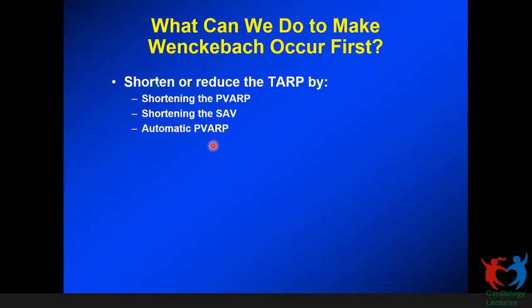So in a normal pacemaker age group of patients who will be 65 or older, the nominal settings will be appropriate. The upper tracking rate will be 130 beats per minute, which will give 1:1 tracking. And when the sinus rate is between 130 and about 150 beats per minute, it will provide Wenckebach. And when the sinus rate goes above 150 or 160, the pacemaker will exhibit a pacemaker 2:1 block. So at nominal settings, in a normal pacemaker age group of patients, you need not worry about all this behavior.